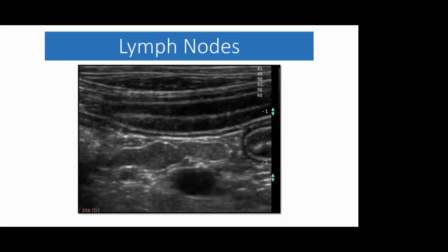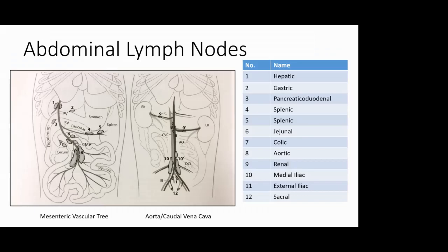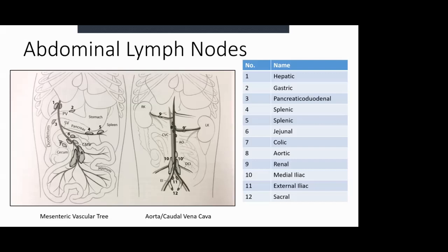If we start with the abdominal lymph nodes, we tend to find them clustered around the vascular trees, the blood vessels. So we tend to find abdominal lymph nodes around the mesenteric vascular tree, up to the portal vein, or clustered around the aorta and the caudal vena cava. From the list on the right, there's a whole host of different lymph nodes that you can find in the abdomen.